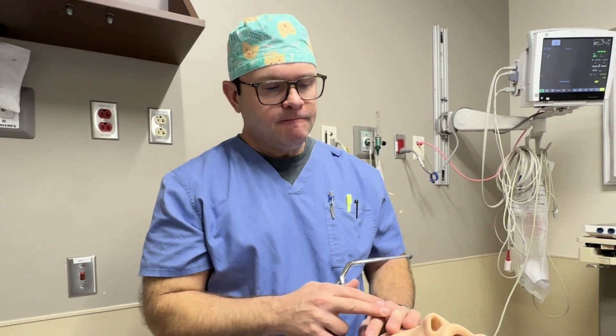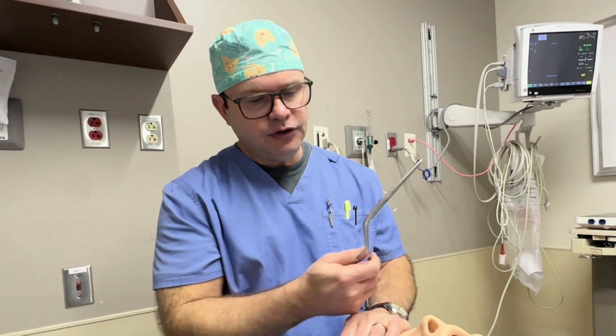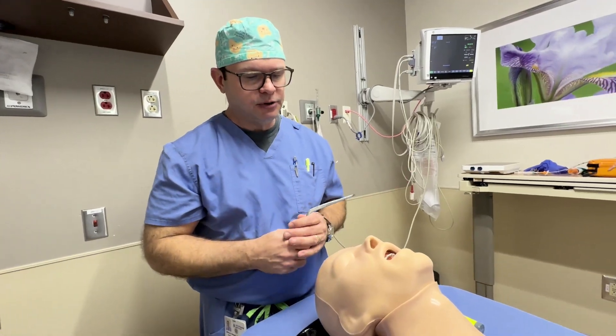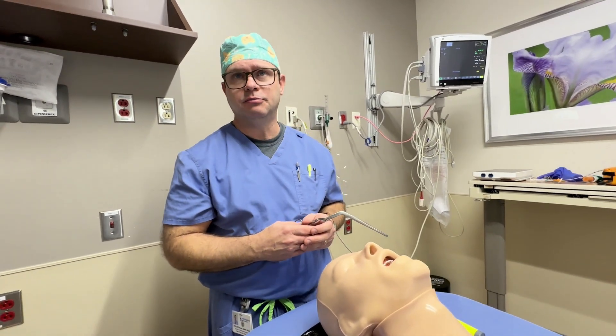I'm assuming anesthesia does not use blind nasotracheal intubation at all and that you'll mostly use McGill's. Typically now, with the ubiquity of fiber optic scopes, if I do a nasal approach, it's almost always going to be with the fiber optic scopes. And the most common application I use for McGill's now is severe angioedema with macroglossia.